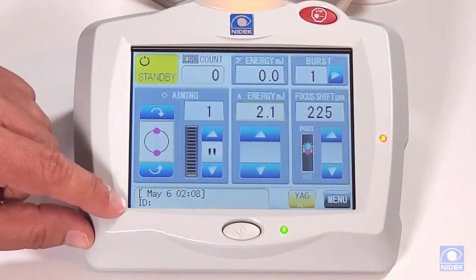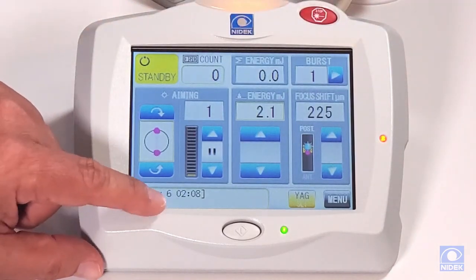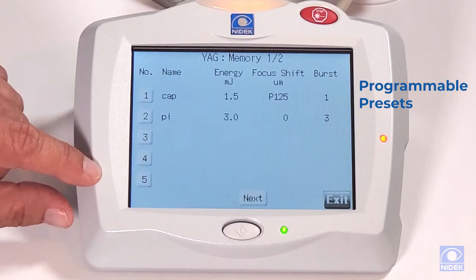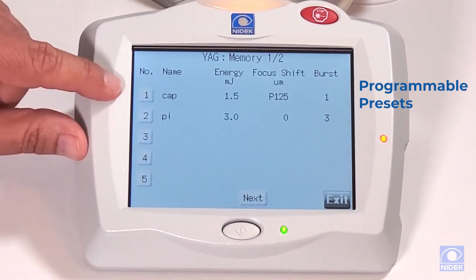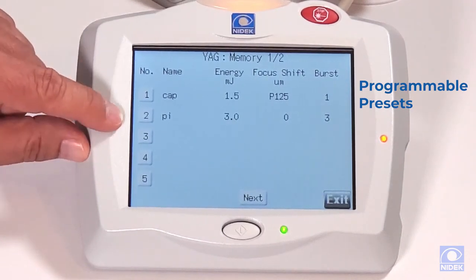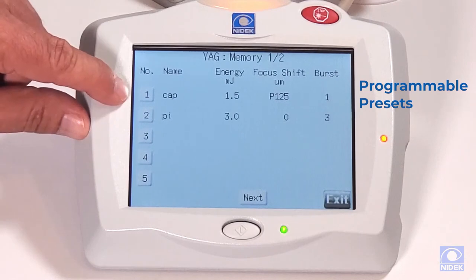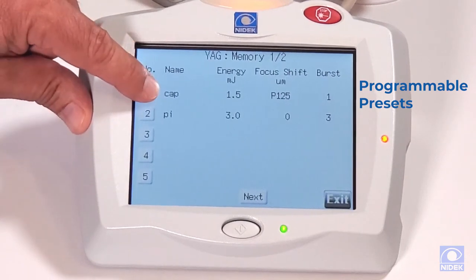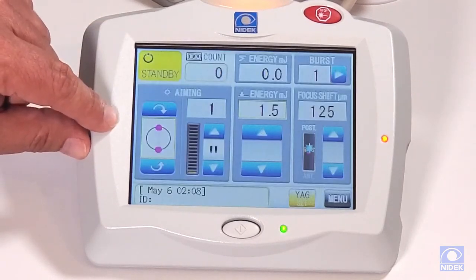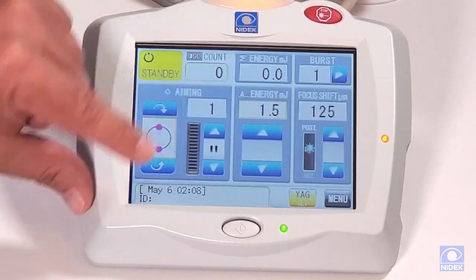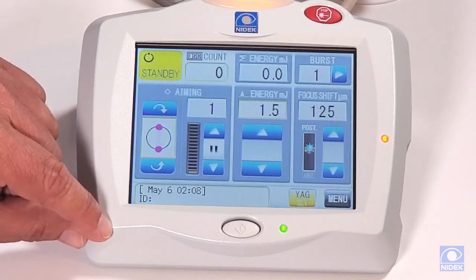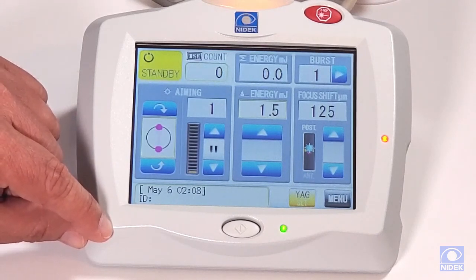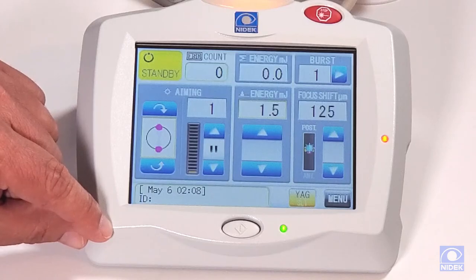This is a nice feature that we have — our memory. We can pre-program any type of treatments that we perform, such as capsulotomy and PI. If I select number one, it's going to put in all my settings that I normally use for my capsulotomy. So it's quick and easy and you don't have to remember all of your settings.